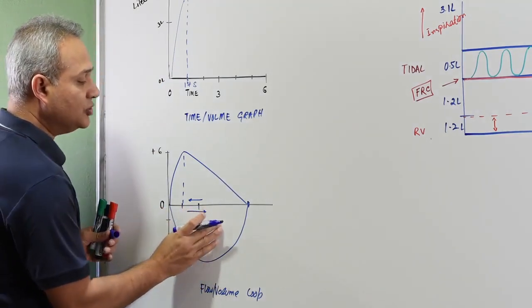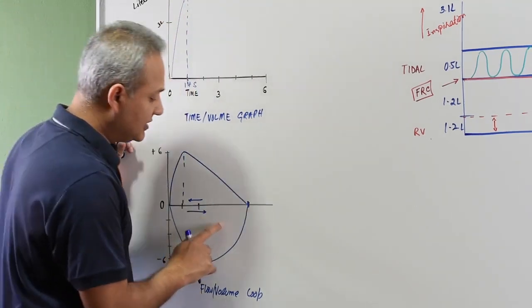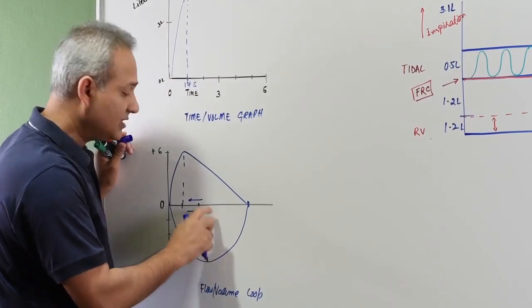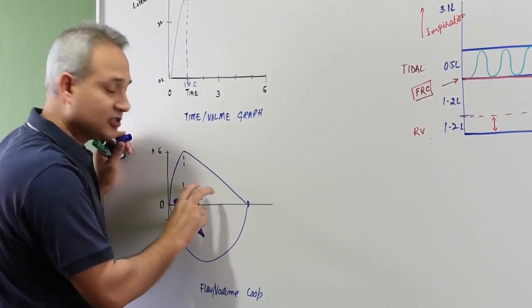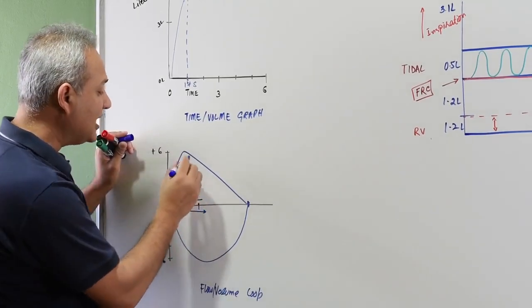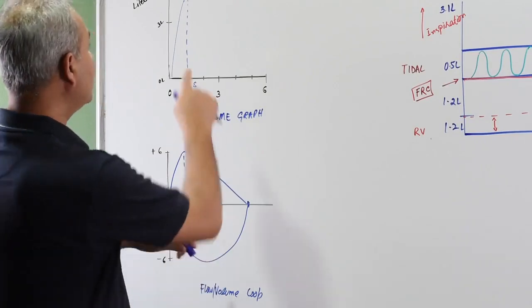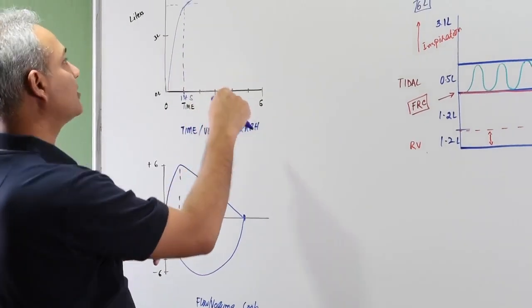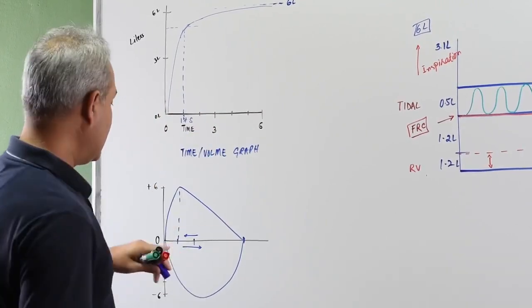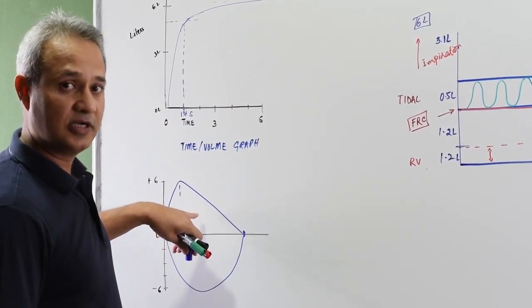So now what is the use of this? We have the same information here as well. Look, the use of this is that in certain pathologies, the quality of this graph, not the quantity, would change, the shape will change. You can look at the shape and say there is a problem. Looking at the shape of this graph and then saying there is a problem is more difficult, and doing that here is easier. That's all. That is why this is useful.